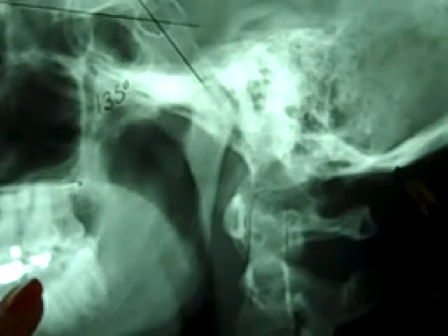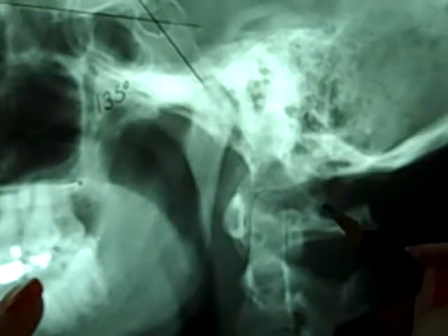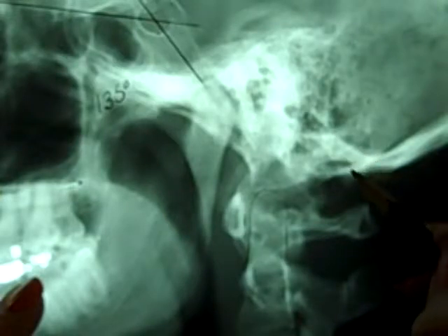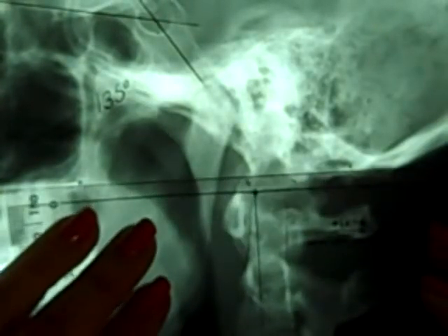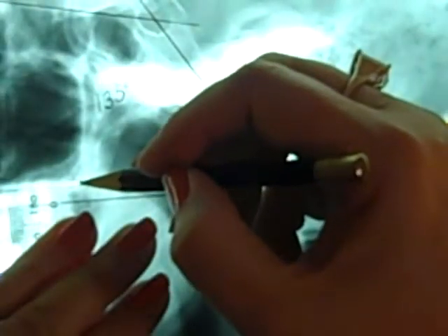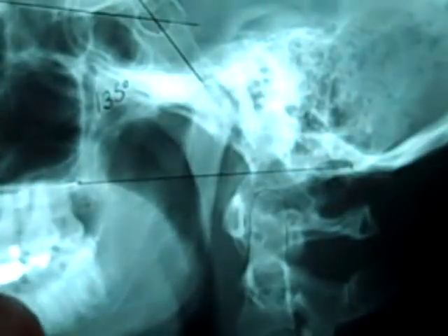Now this can cause hardship for some people, but if you follow the back of the lateral mass, which is this structure right here, up, you see there's kind of a sideways U shape, and that is the posterior aspect of the foramen magnum. So we draw a line using those 2 points, and again you're looking to see, is the odontoid above the line?